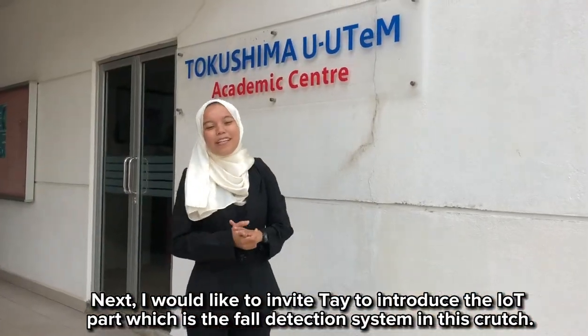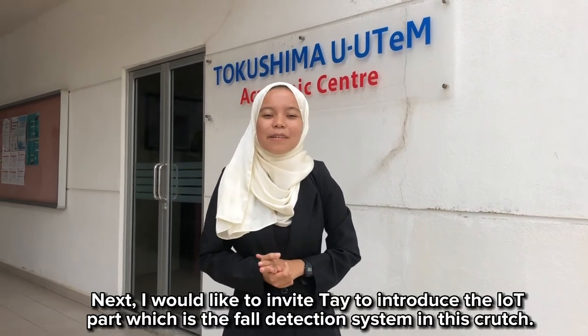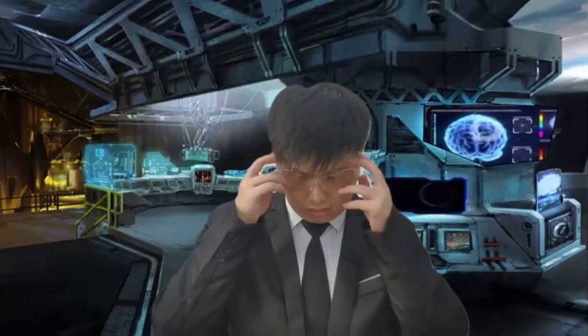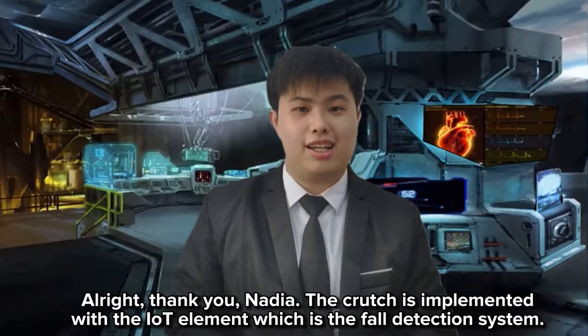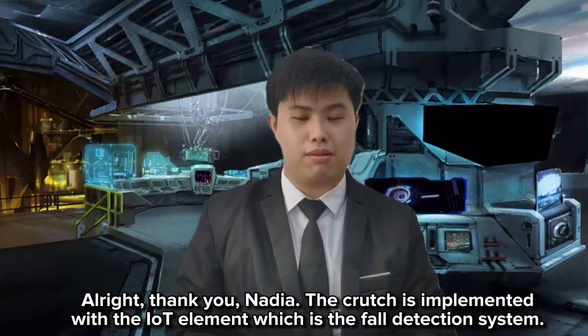I will now invite Teh to introduce the IoT component, which is the fall detection system in this crutch. The crutch is implemented with an IoT element: the fall detection system.